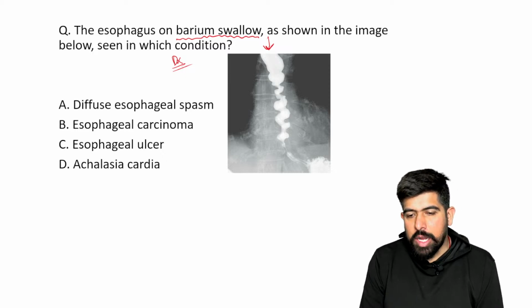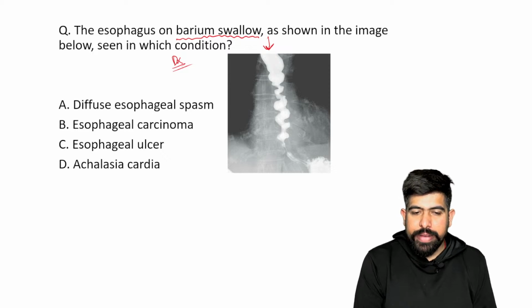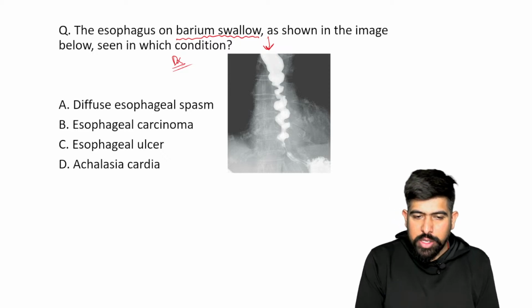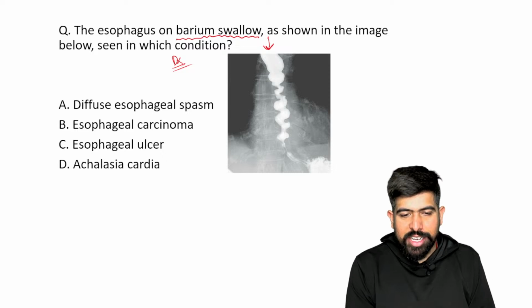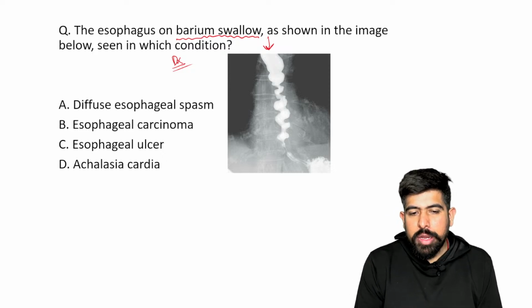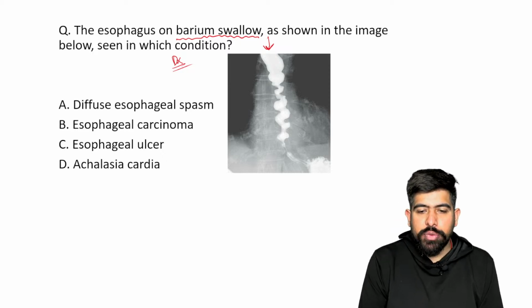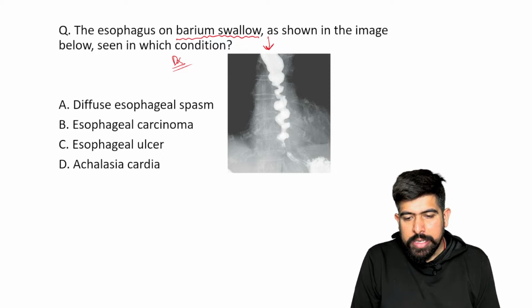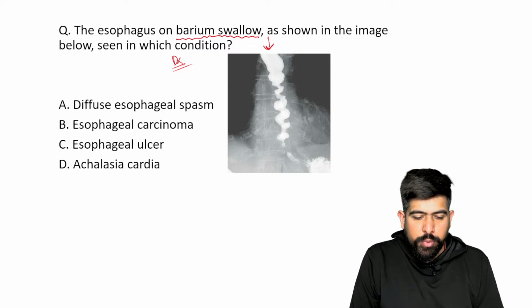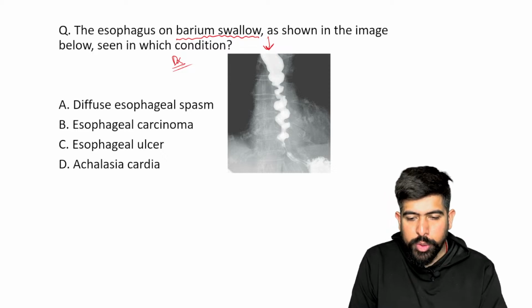Very good, guys. Now I can see your comments. I can understand, yes, there was some delay. Very good. So first of all, I hope you understand and you replied very well. Option A is the correct answer, because what we are seeing is the very classical image of the corkscrew appearance. Yes, very good. I hope you know about it.